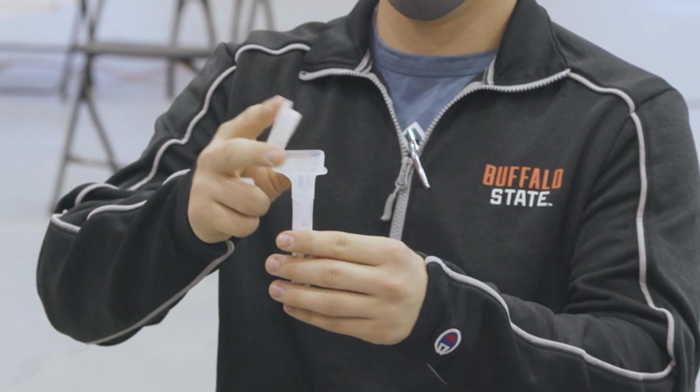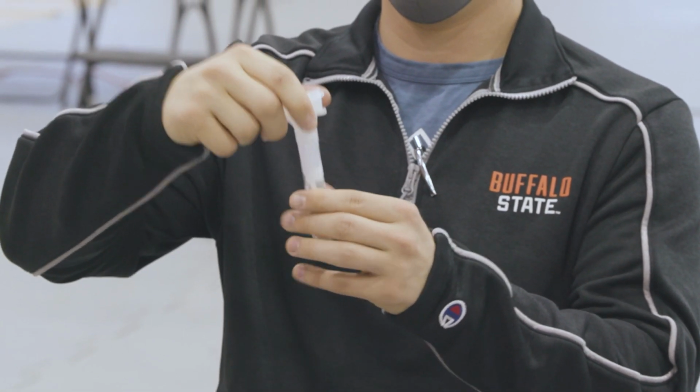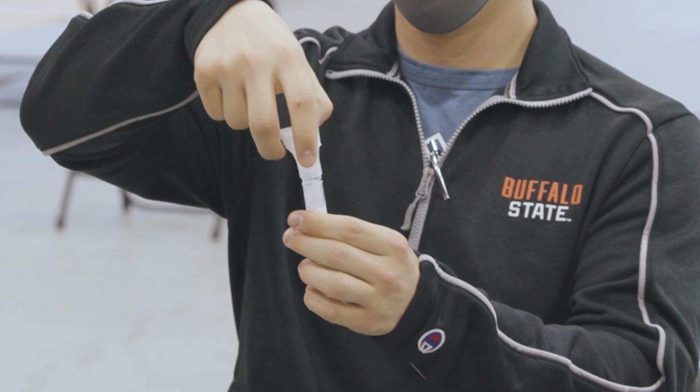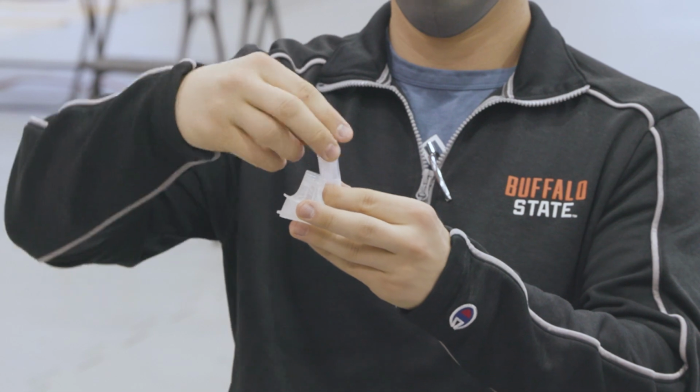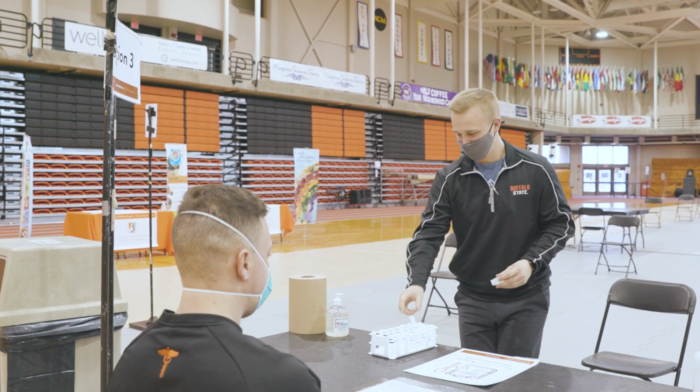Once complete, close the cap to release the reagent into the sample and shake. Remove the reagent cap and seal with the plastic cover. Deposit your sample at the table and sanitize before exiting.